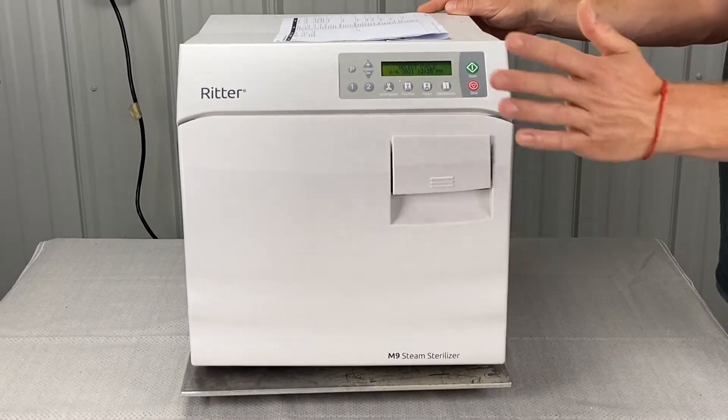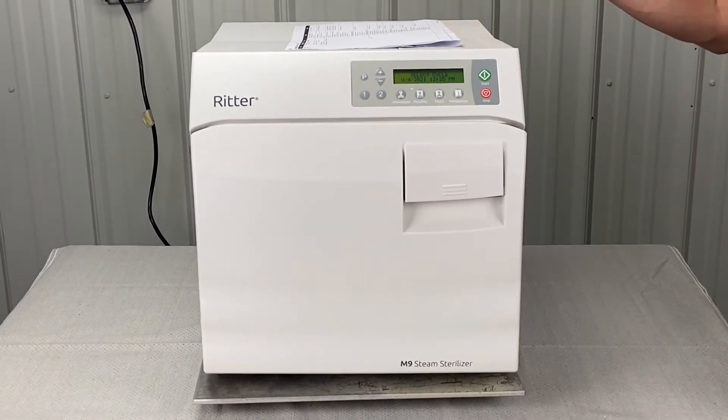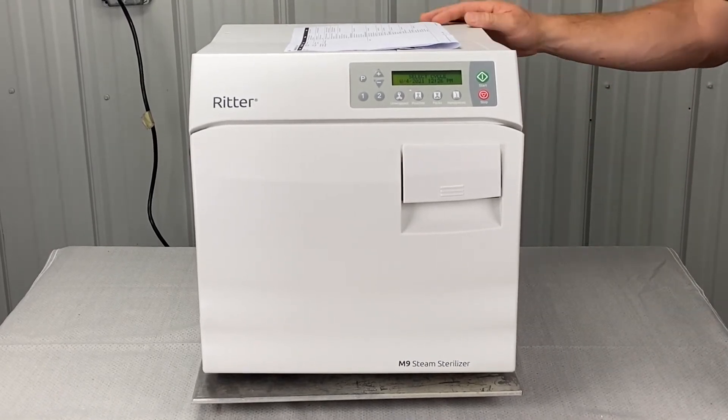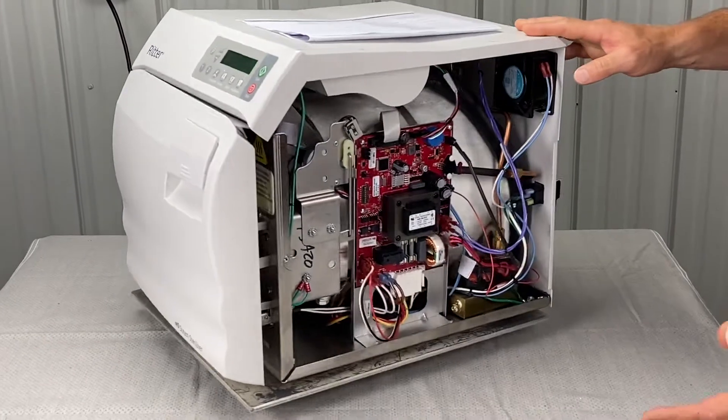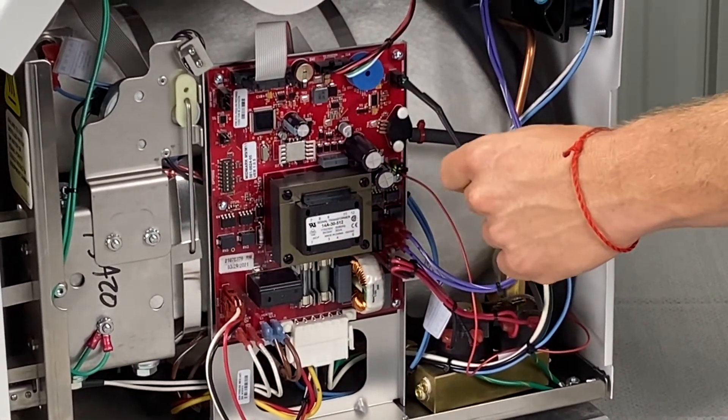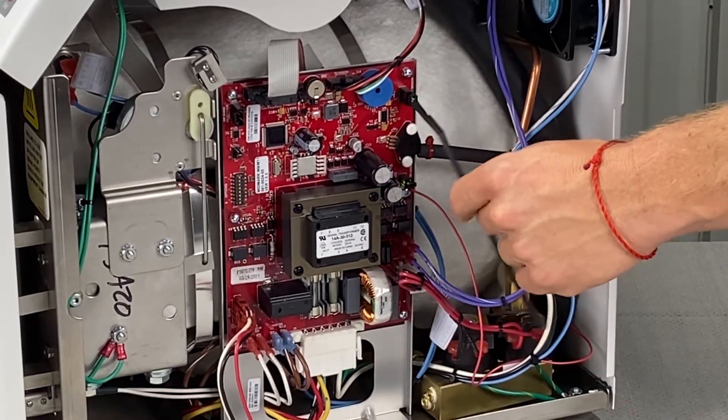Shut the door and run an empty cycle. If the problem persists, it's going to be either the board is failing or the temperature sensor is failing. If you're willing, we can do a couple of tests — an output test of the PC board or a resistance test of the temperature sensor.